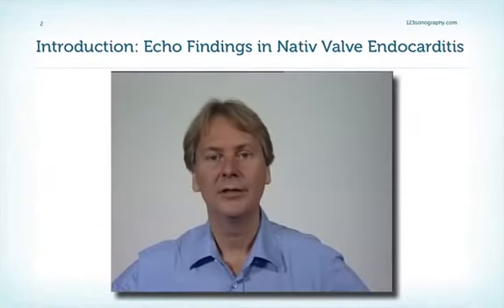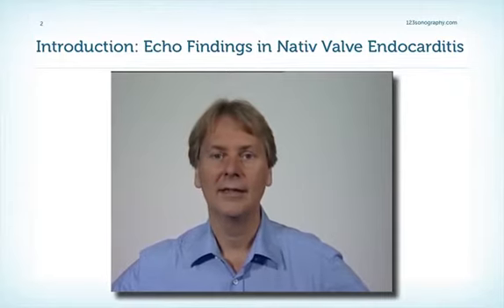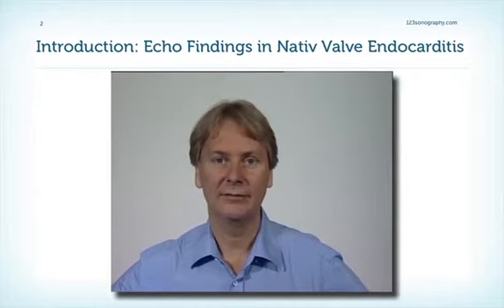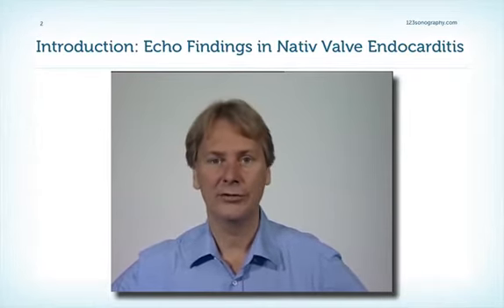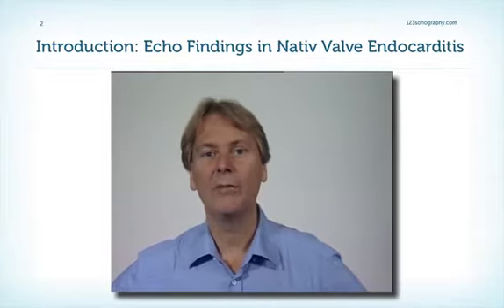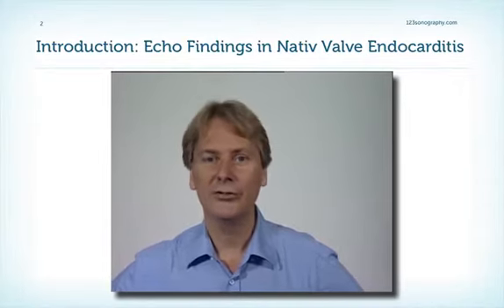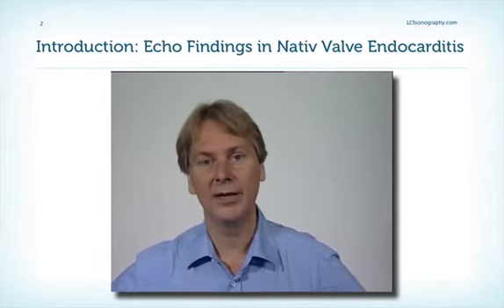In this chapter, we're going to deal with one of my favorite topics, endocarditis, a disease where echocardiography really makes a big difference, as you will see. Well, endocarditis has actually been recognized for many, many centuries. The first reports go back to the year 1646, where a man called Rivier first described structures on the aortic valve which also seemed to obstruct the outflow of blood.